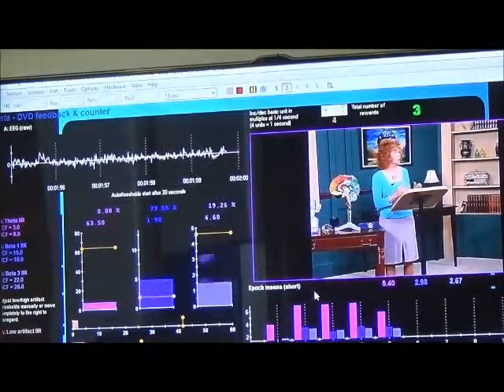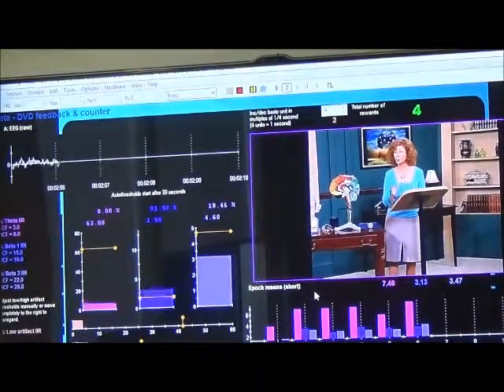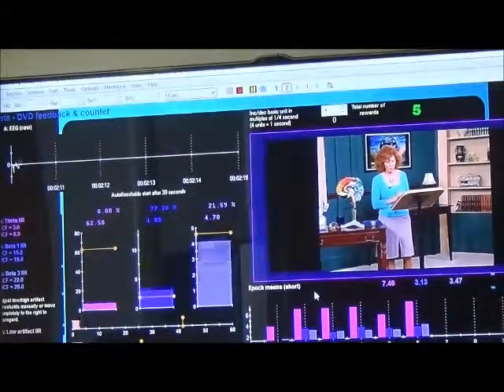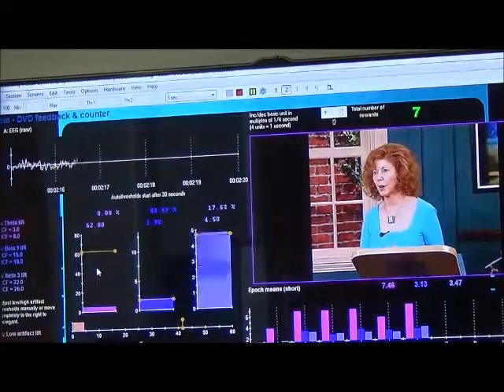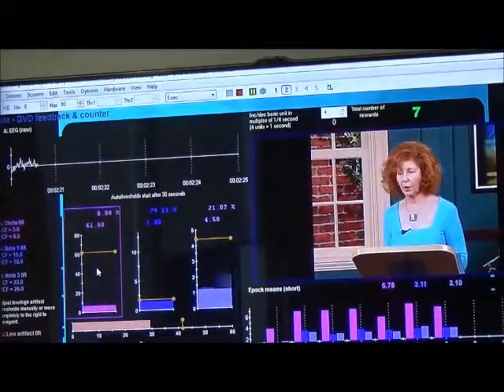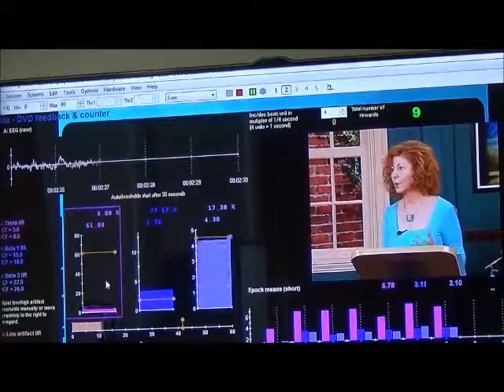On the upper left part of the screen, you can see that there is a raw signal, so you can see the quality of the signal throughout the training. If you're using a dual screen setup, you could have all of the more technical information, the raw signal, the bar graphs, the settings instruments, which are the ones all the way on the left that allow you to change the frequencies that you're training.